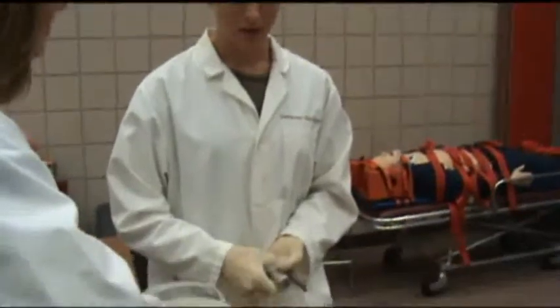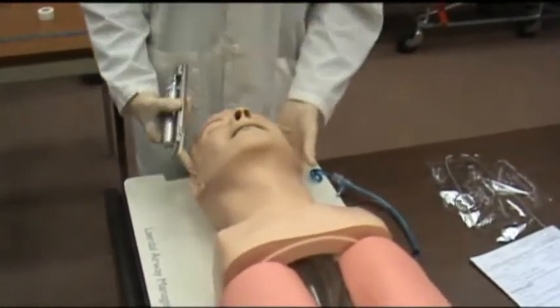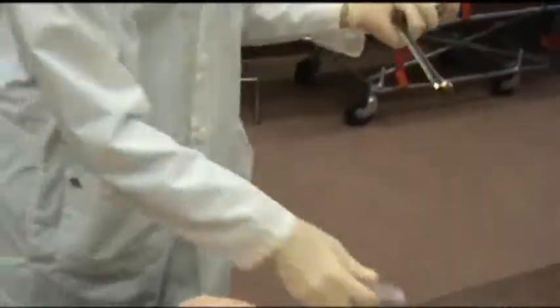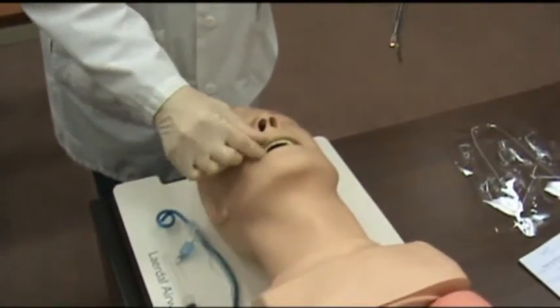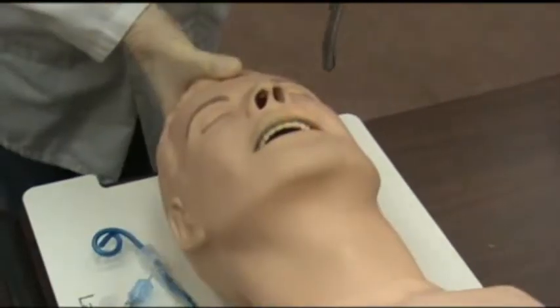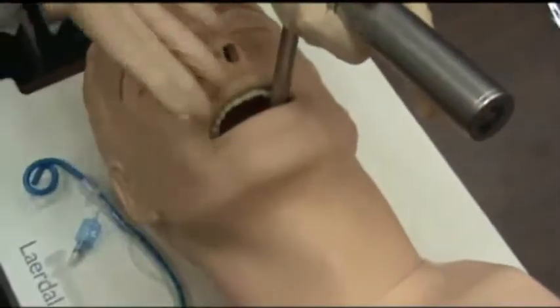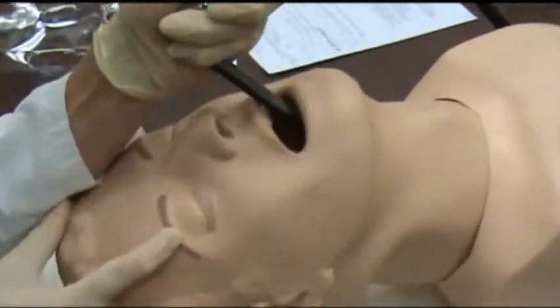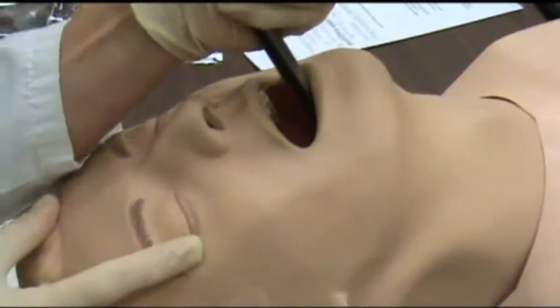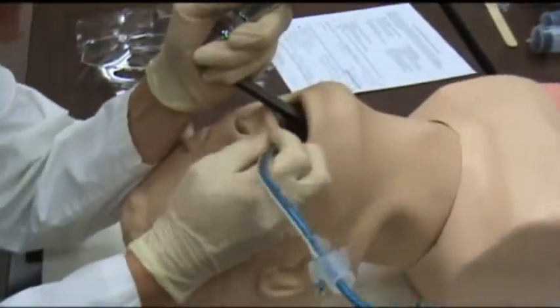For the standard procedure, once your patient has been pre-oxygenated for about 30 seconds, place them in a neutral sniffing position and open your laryngoscope. You hold it in your left hand, even if you are right-handed. Insert the laryngoscope into the patient's mouth on the right side using the scissor method to open the mouth, then move the tongue over to the left. Once you find your landmarks — the glottic opening — you will see the vocal cords, and lifting the epiglottis, you insert your endotracheal tube.